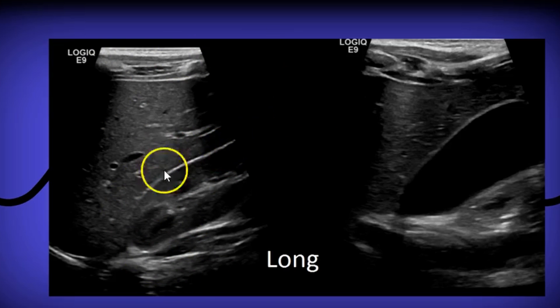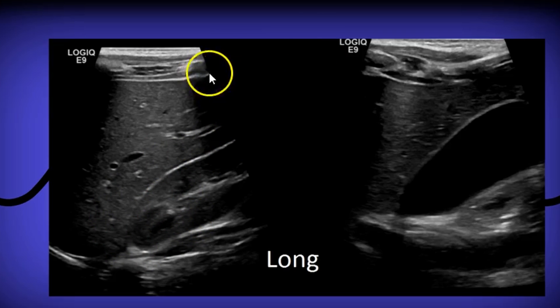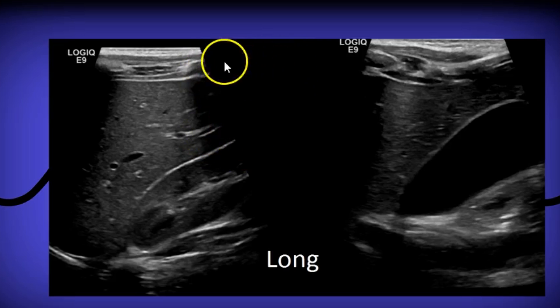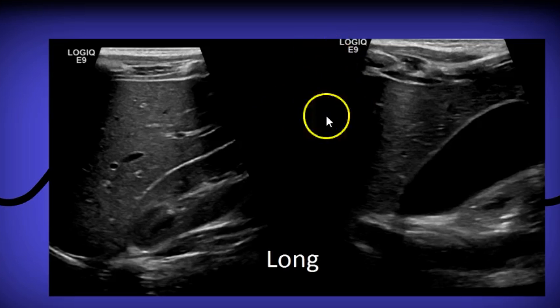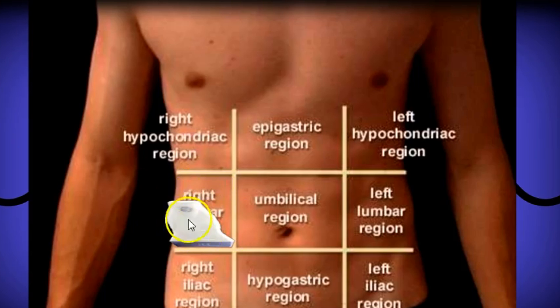In sagittal, Morrison's pouch is a good place to rule out free fluid. If you're doing a four-quadrant scan or a FAST scan to rule out free fluid in a trauma patient, you want to make sure you include the tip of the right lobe of the liver, because sometimes fluid accumulates there. You also have your sagittal gallbladder where you can rule out gallstones.